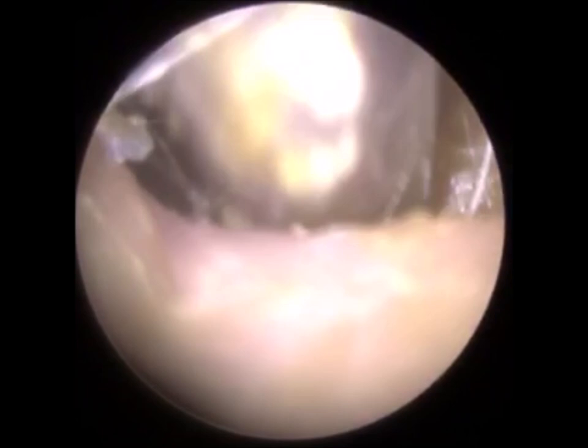I've just gone in with the Jobson horn, and again, I'm still working very hard at lifting this plug of skin off the canal wall. And you can begin to see it loosen around the canal wall. You can see the fresh layer there in between the darker, crustier skin in the middle. And at the back there, you can see some contact bleeding. As I'm elevating and retracting this dead keratin from the canal wall, because it's so compressed, you can see a bit of bleeding occurring there.